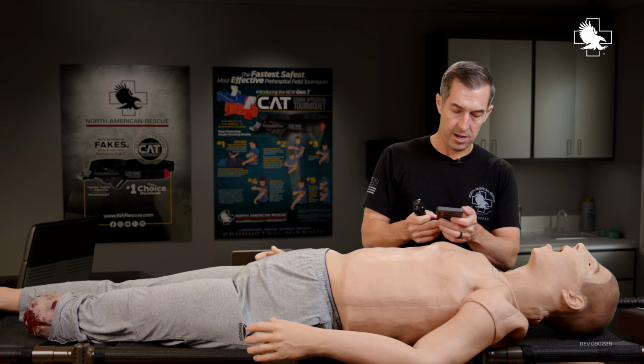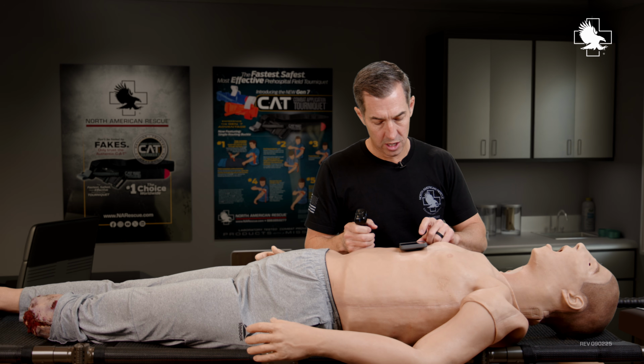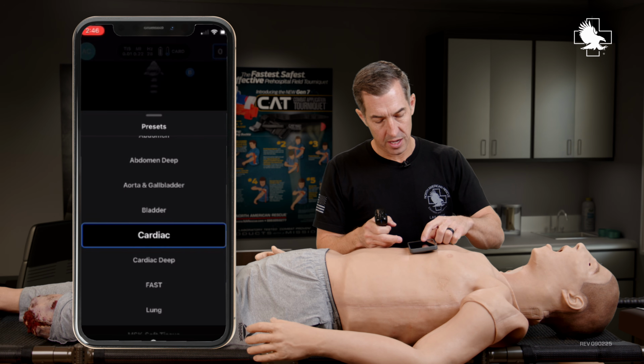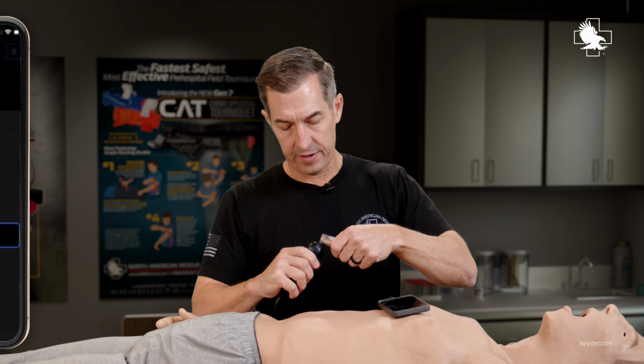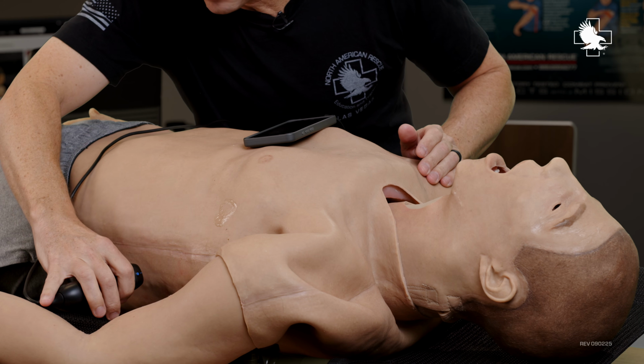We're going to make sure that we've got our probe connected. Takes about 2 seconds to connect. We'll go to presets, and I'm going to put it on FAST. Make sure I've got gel on mine. And then the first thing that I'm going to do is I'm going to place down over here.